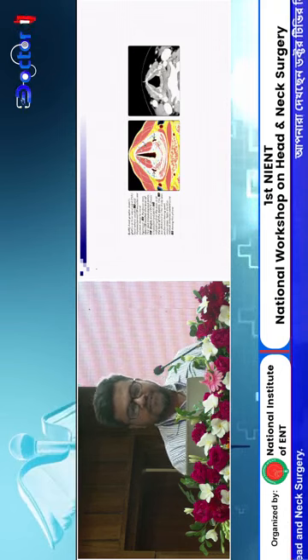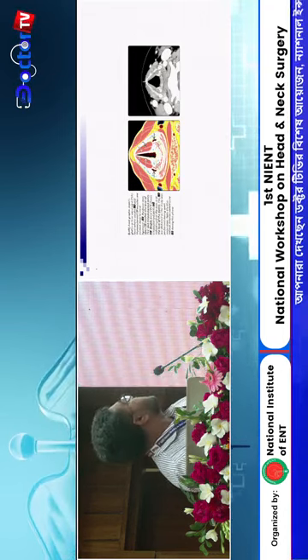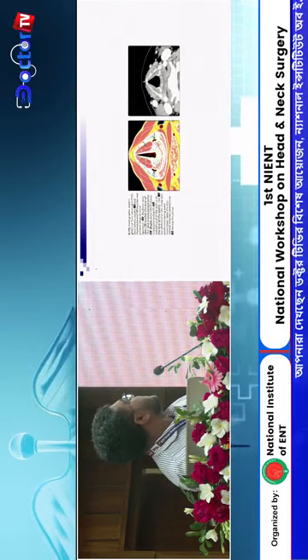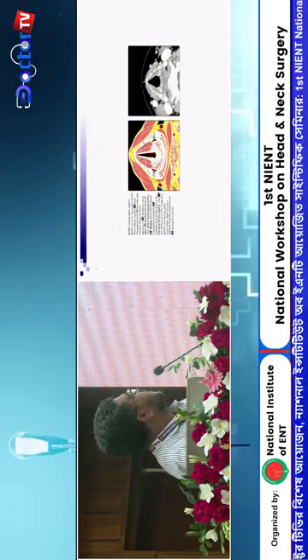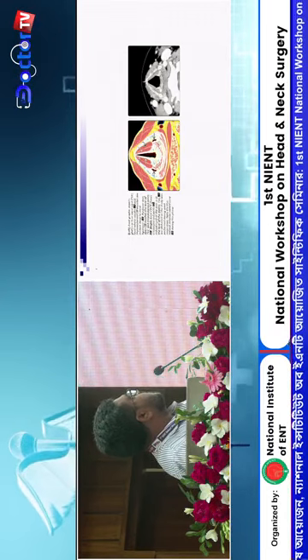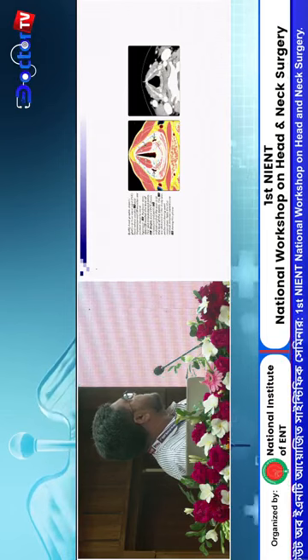Graphic representation. So this is the cricoid cartilage, this is the arytenoid cartilage, this is the cricoarytenoid joint, and this is the glottic area, the vocalis and thyroarytenoid muscle. And in CT scan, we identify the cricoarytenoid joint, and the area is the glottic area.